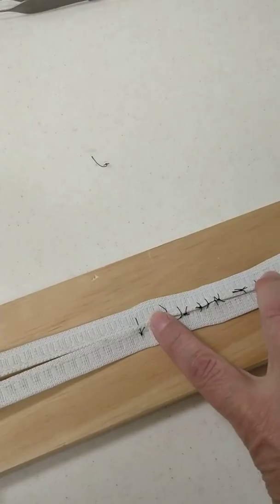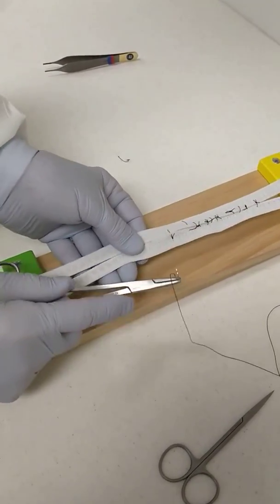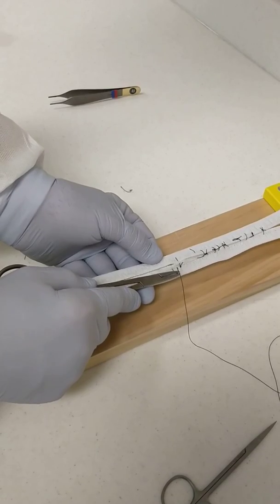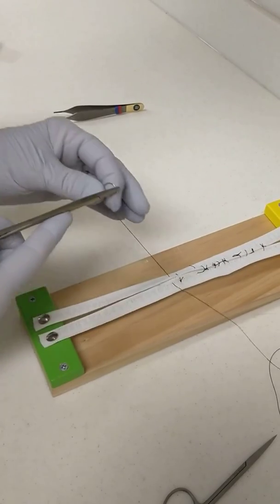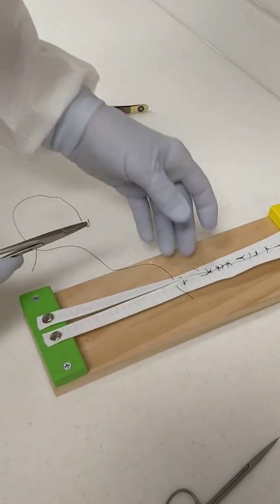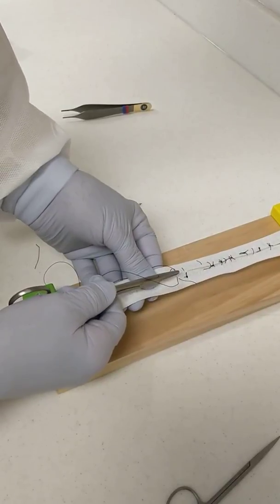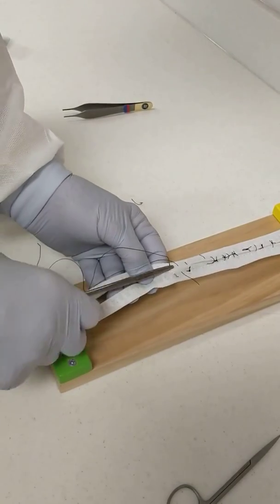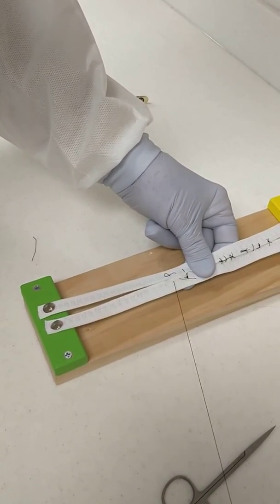The horizontal mattress suture is like a box. You pass the needle through the tissue, just like you do on a simple, and you come down about five millimeters or so, and you pass it back in the opposite direction. You're trying to keep the same amount of tissue between each of those passes.